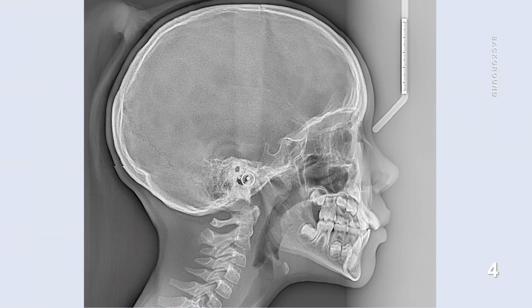Now, plenty of dentists will take panoramic x-rays to look for pathology and assess the dentition development, but interpreting and making use of the lateral cephalogram is really what makes orthodontics a specialty. For clinicians, these images relay clinically diagnostic information for orthodontic and orthognathic treatment planning and helps predict future growth patterns. Specifically, it lets you look at the dentition and its alveolar housing and figure out the relation to the rest of the skeletal structures. With this information, the orthodontist can then determine the global movements that need to take place so we can fit the teeth, which are the pieces of the puzzle, together properly.